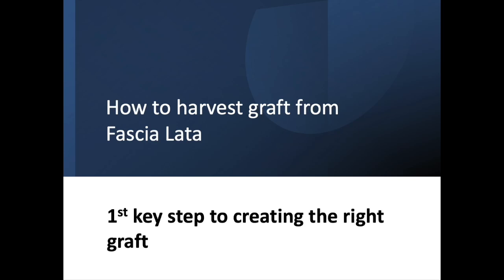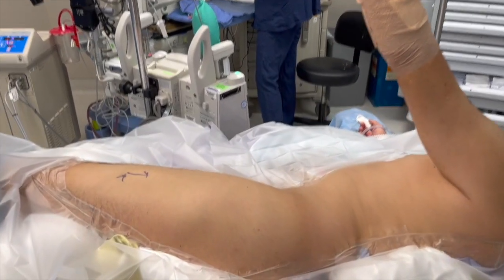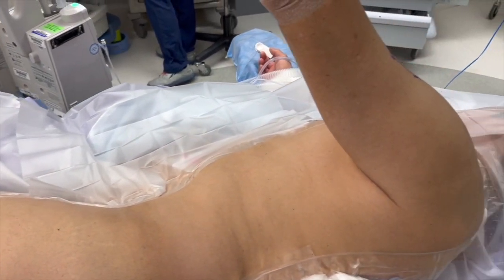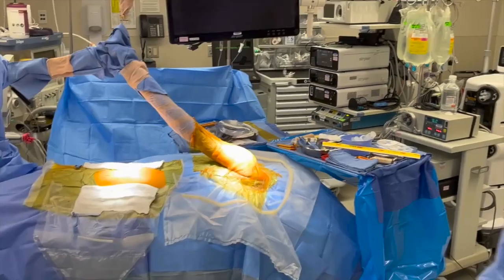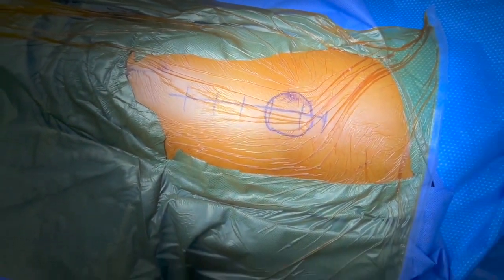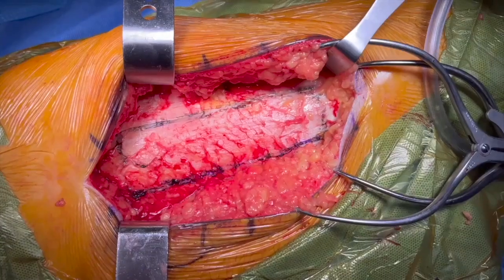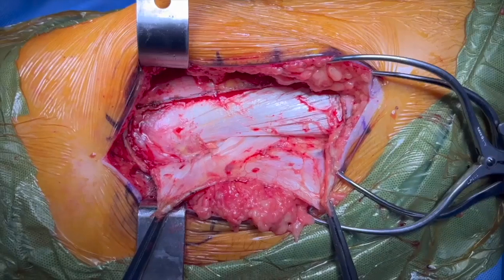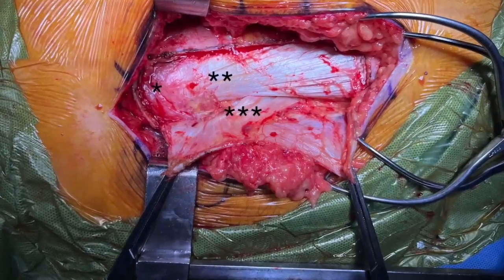Learning how to harvest the graft from the fascia lata is the first key step to creating the right graft. Here is our operating room setup in lateral position. Here's a closeup of the left upper thigh. The circle is the greater trochanter — this is a right hip with the left side being the greater trochanter. Here we are marking the graft outline and harvesting the graft, and you can see the intermuscular septum quite well, marked with the three asterisks.